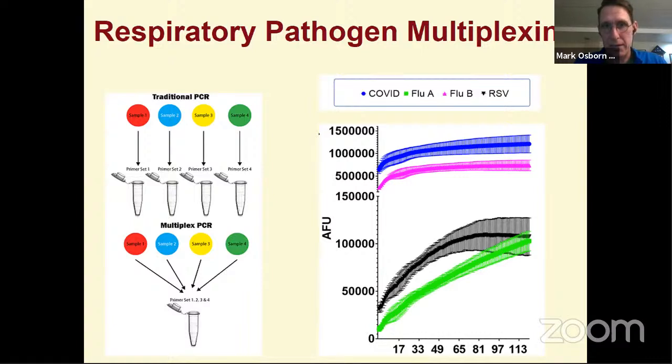And so when we did this, what we saw again in rapid order is that the fluorescent signal generated by the matched guide RNA to a particular pathogen, COVID-19, influenza A or B, or RSV, generated a signal only when that corresponding target amplicon was present, that was matched to the guide RNA. And by having four different colors, we were able to perform this on the same sample.